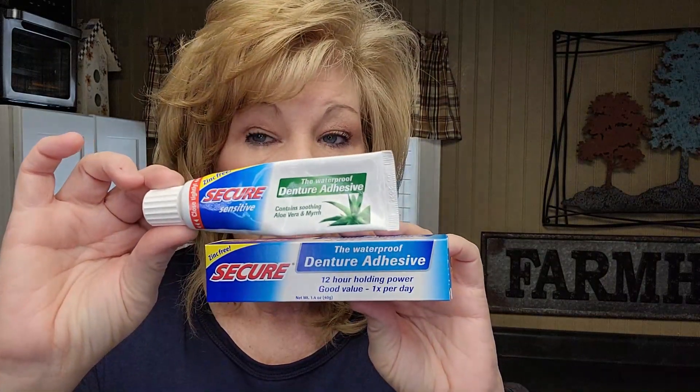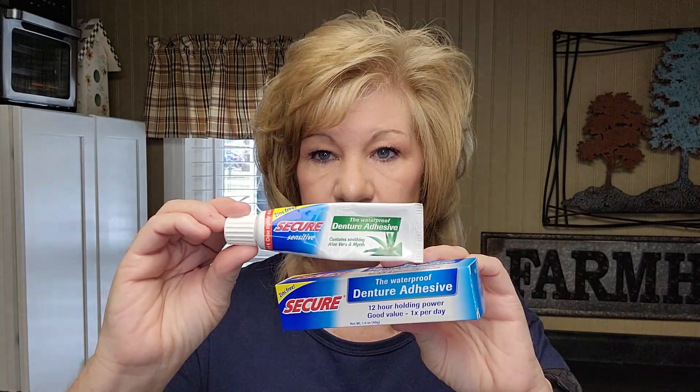My very favorite is Secure. They have Secure with aloe and myrrh, and then they have the regular Secure. These are my go-to's. They both hold great — don't get me wrong, you could get either one. I reviewed eight products total.